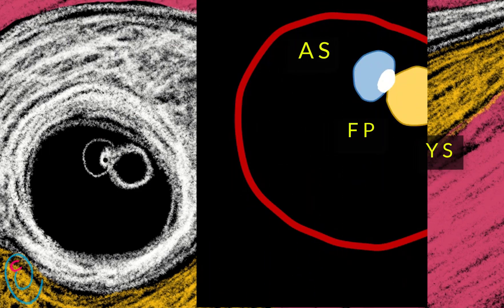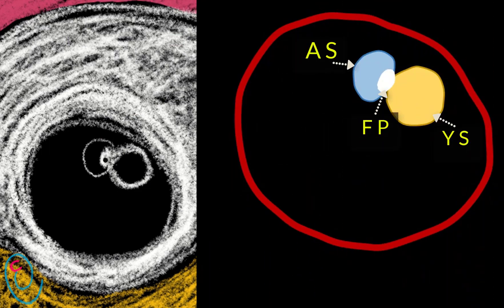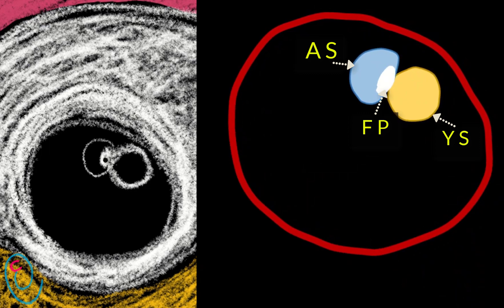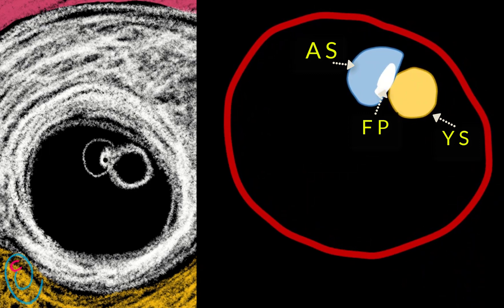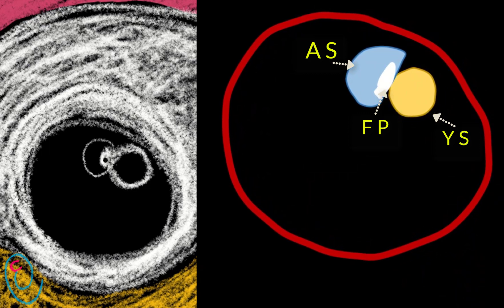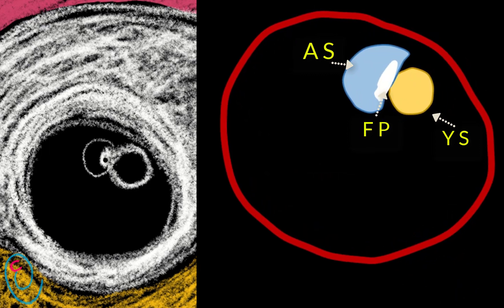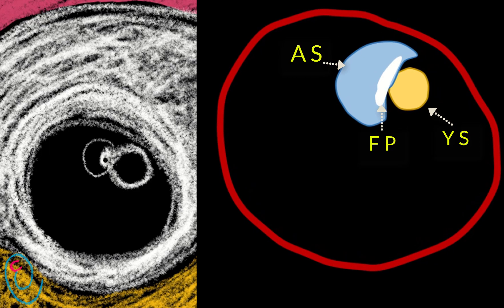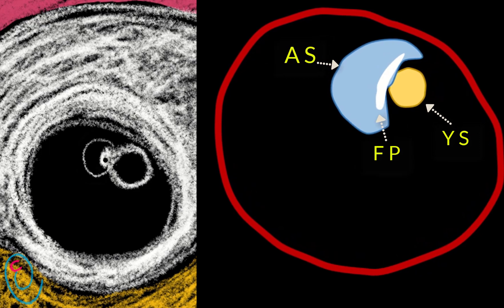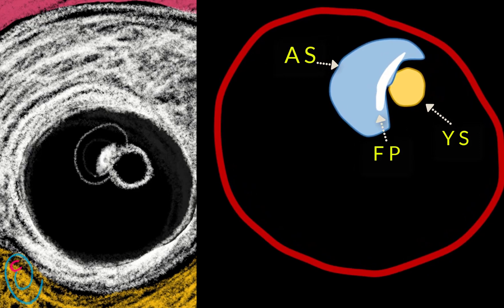Before 10 weeks, the fetal pole, amniotic sac, and chorionic sac will grow at a similar rate, while the yolk sac is decreasing in size.